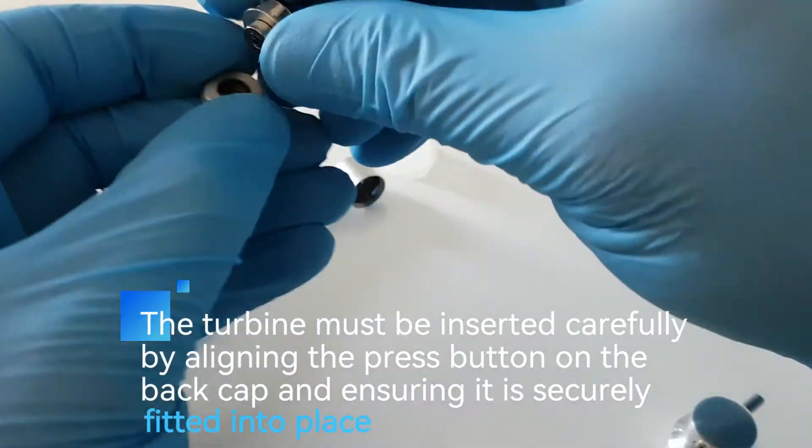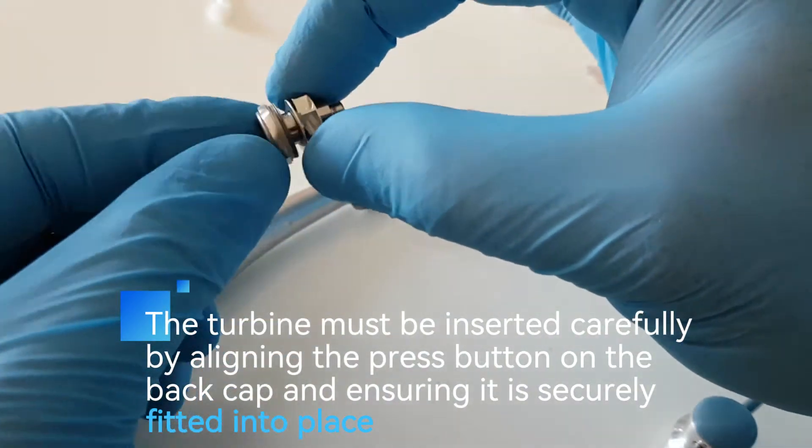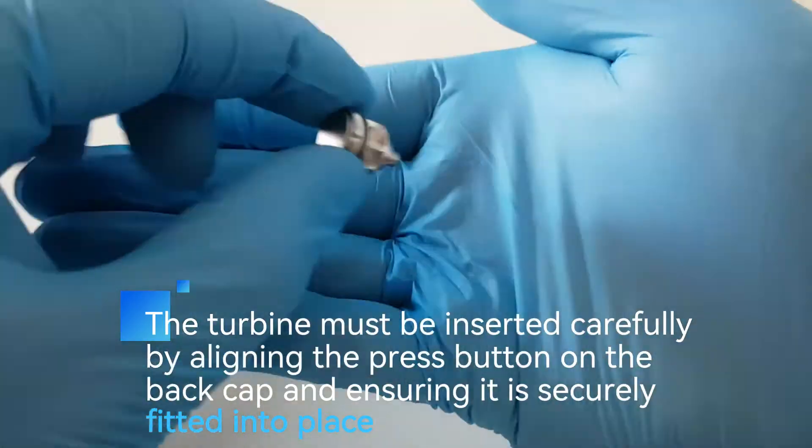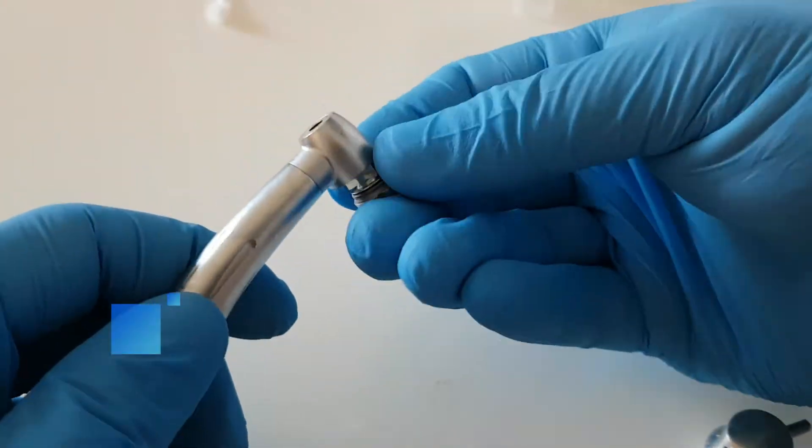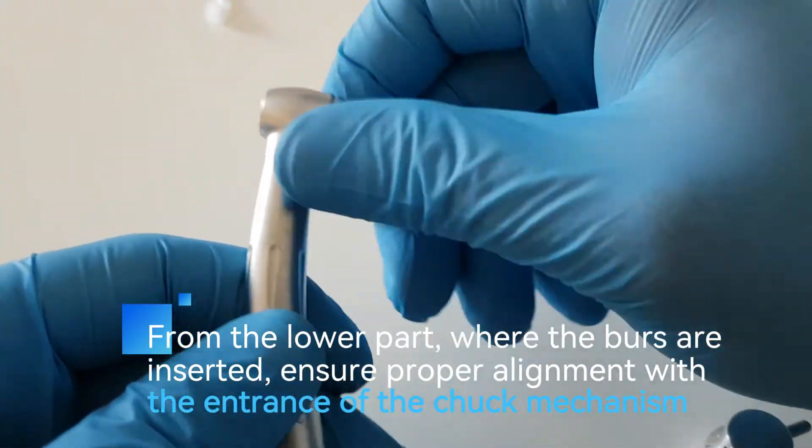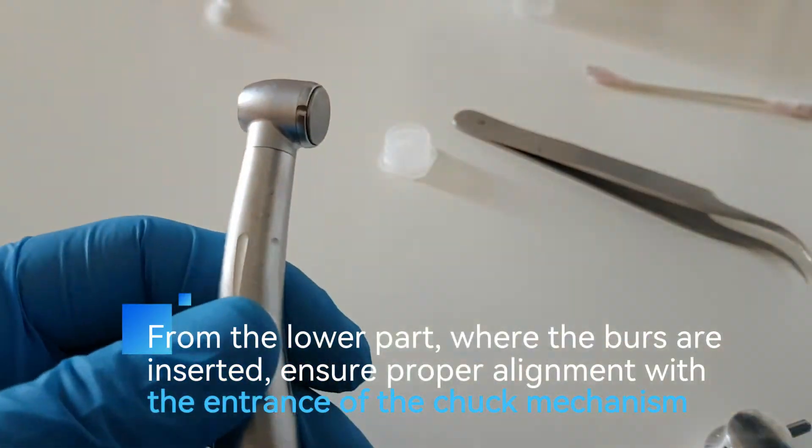The turbine must be inserted carefully by aligning the press button on the back cap and ensuring it is securely fitted into place. From the lower part where the burrs are inserted, ensure proper alignment with the entrance of the chuck mechanism.